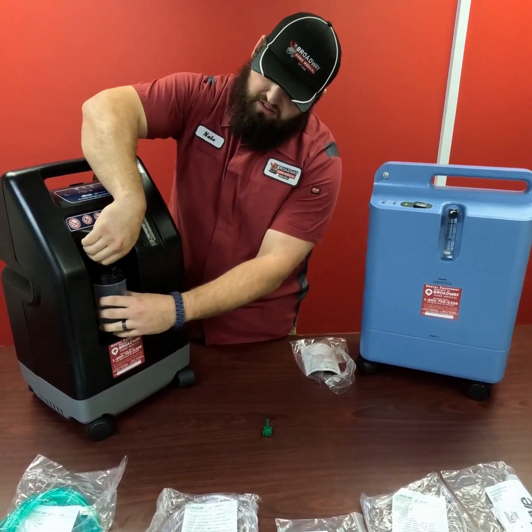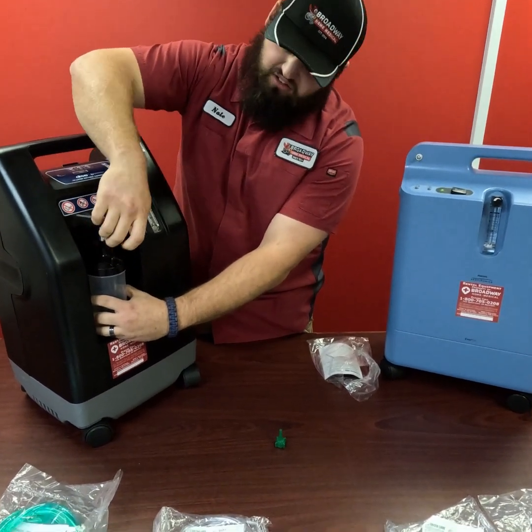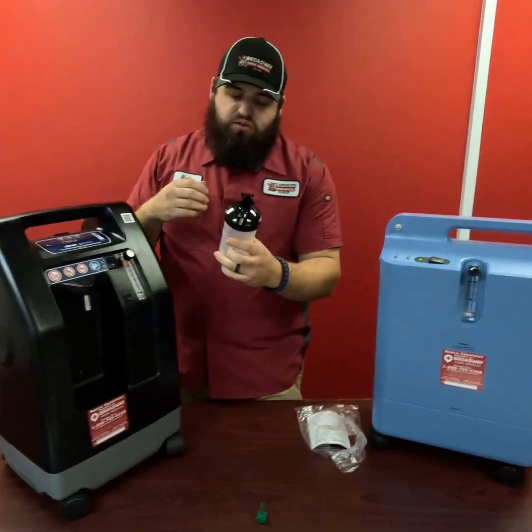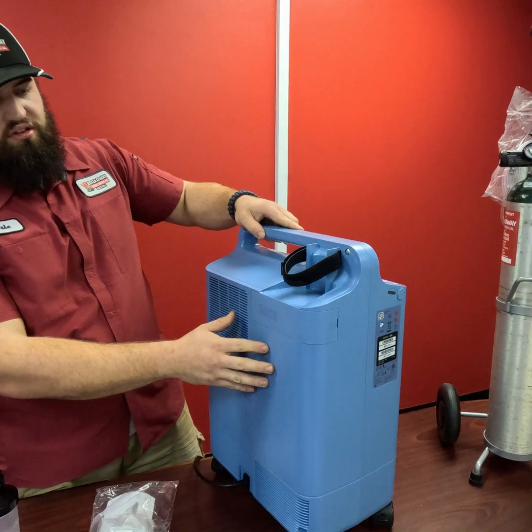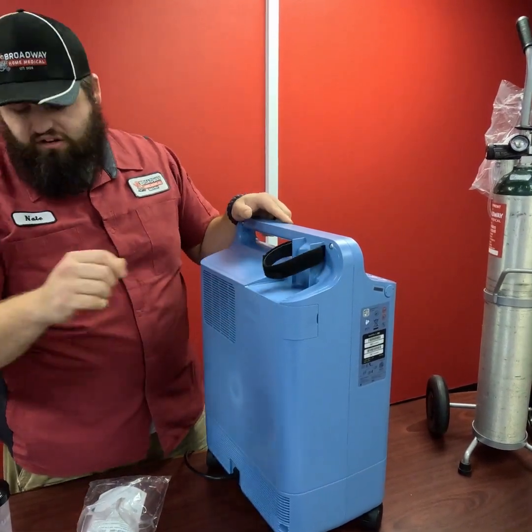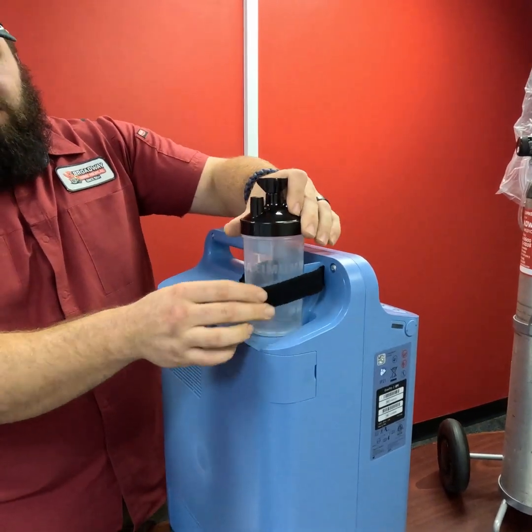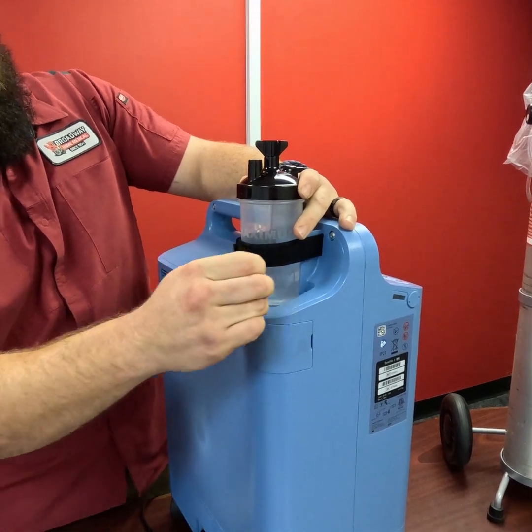So let's go ahead and take this humidifier jar off of this machine and attach it to the EverFlo over here. Now the EverFlo is a little bit different. On the EverFlo, you'll see on the back there is a little ledge with a little strap here, and that's perfect for the humidifier jar. So we'll go ahead and tighten that in here.